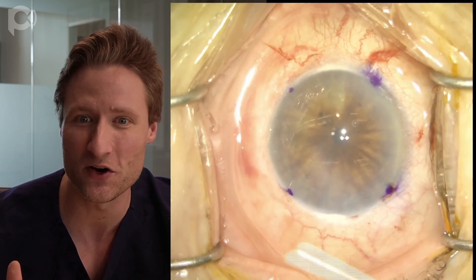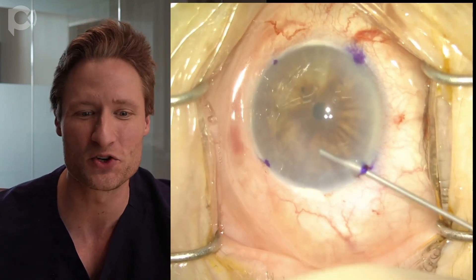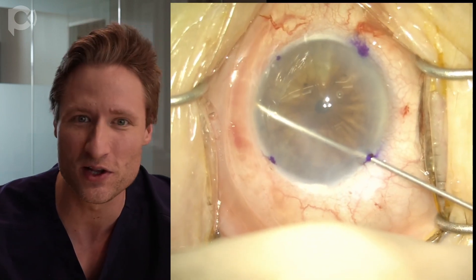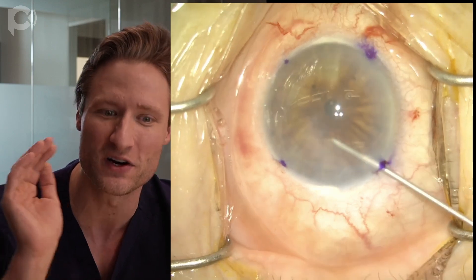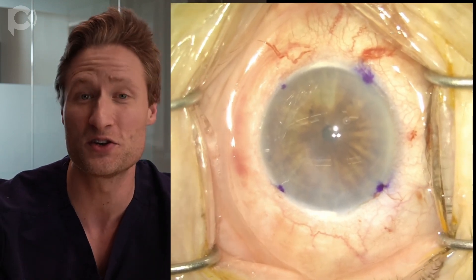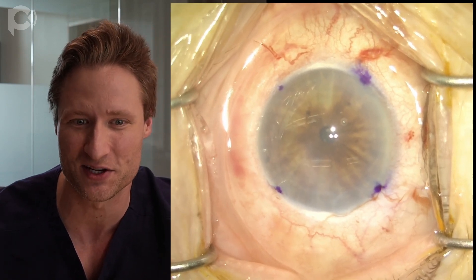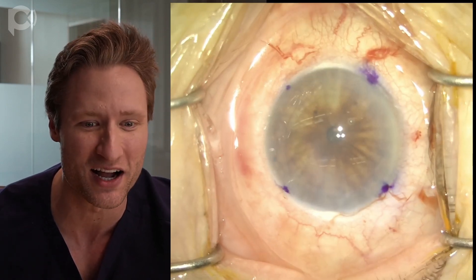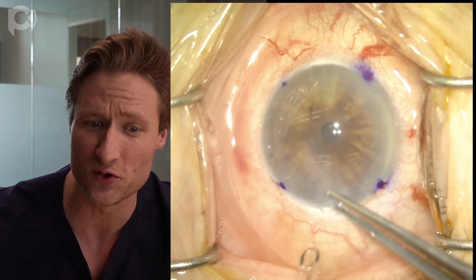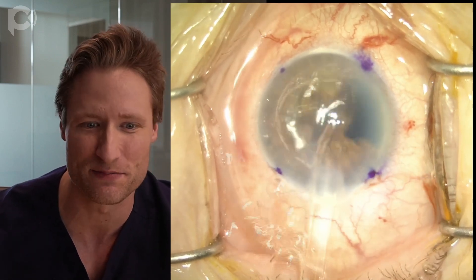You can make an iridotomy in a thousand different ways, but by far the easiest is using a vitrectomy handpiece — a 25-gauge vitrectomy handpiece. I just make two small iridotomies, maneuvering it down into the inferior peripheral iris. I used to make two just for extra assurance that we wouldn't get a pupillary block. I do that under fluid rather than air because you can see what you're doing better, there's no bleeding, and it's simple and one-handed.